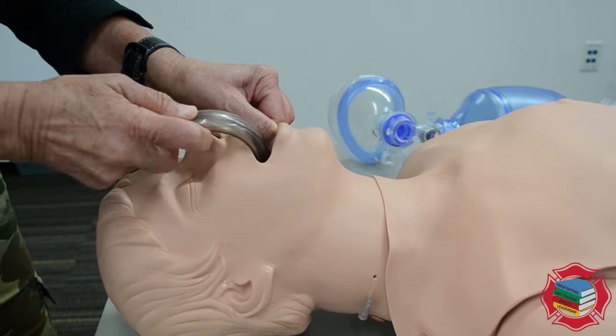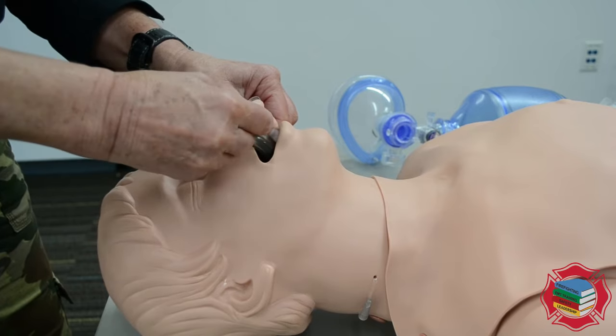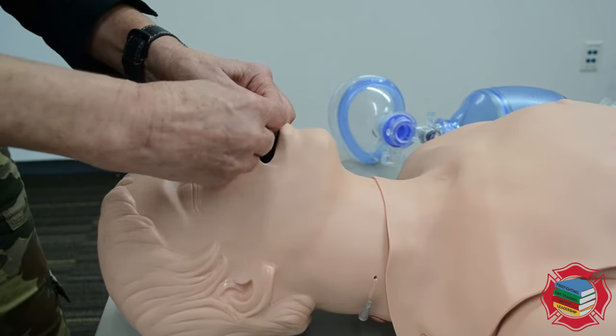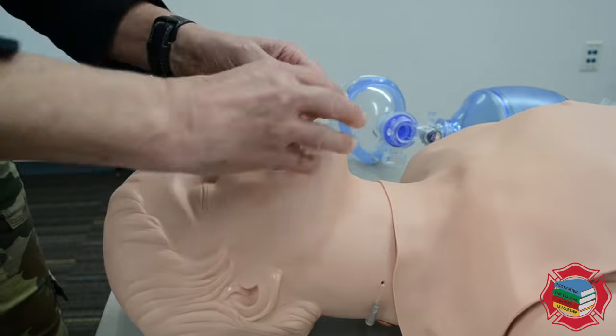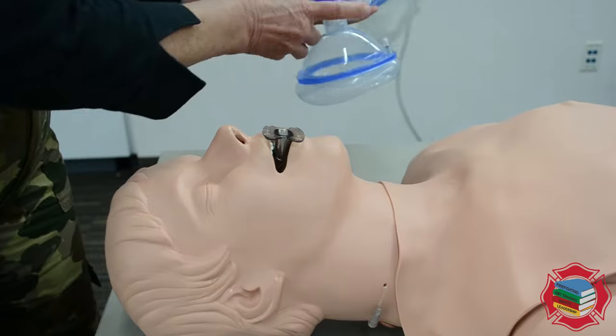I will insert this airway upside down, running it across the hard palate. As soon as I feel the soft palate — indicated by a decrease in resistance — I will rotate it 180 degrees. Now I'm ready to use my bag valve mask.